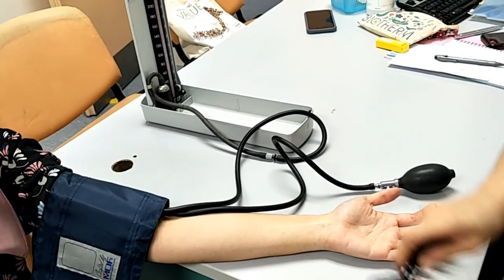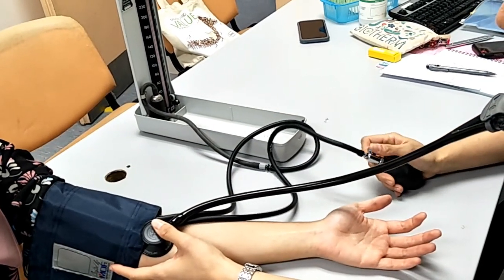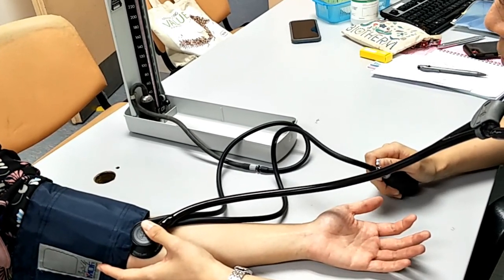Next, place your stethoscope bell or diaphragm over the brachial artery, just below the cuff's edge. Rapidly inflate the cuff to above the estimated blood pressure that you obtained just now with palpation of the pulse.